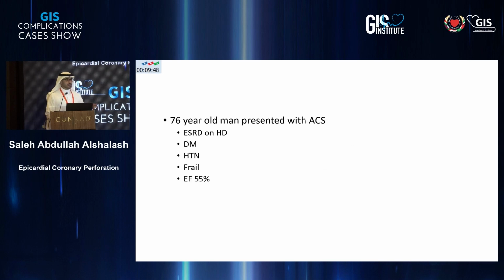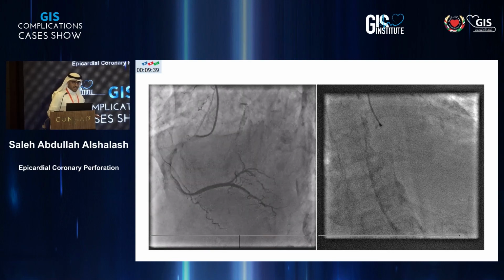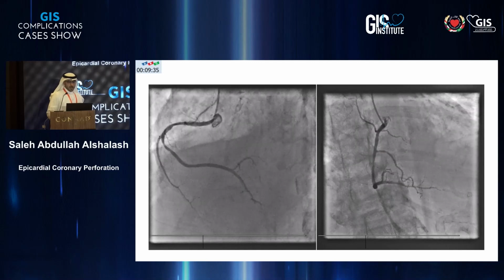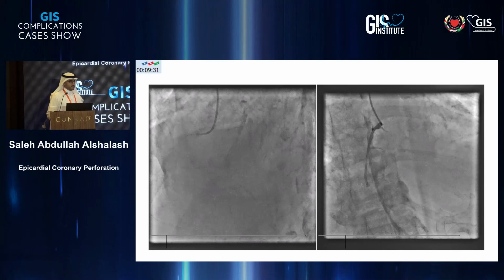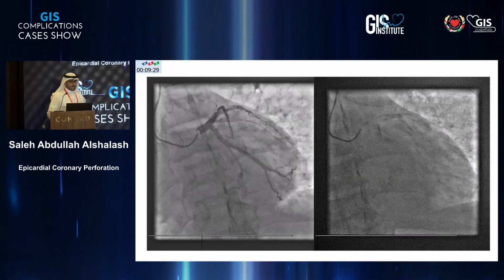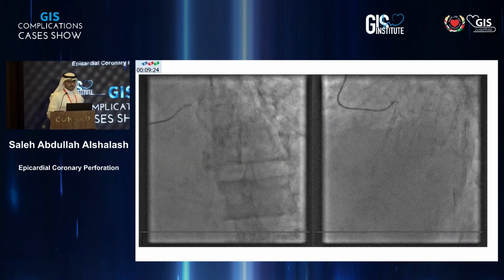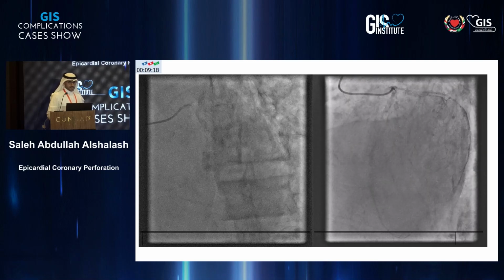Very old man, very frail, diabetic, end-stage renal disease, came in with a non-STEMI, preserved EF. This is the angiogram. So the RCA is really good for his age and comorbidities. You can see the descending aorta, horrible, super calcified. His left system is the problem. Left main and circ are good looking, LAD and diagonal are not. He does not have stents in the LAD. He does not have stents in the diagonal. All of that is just calcium.